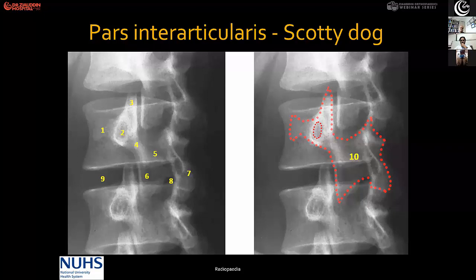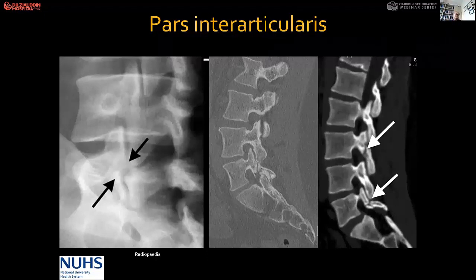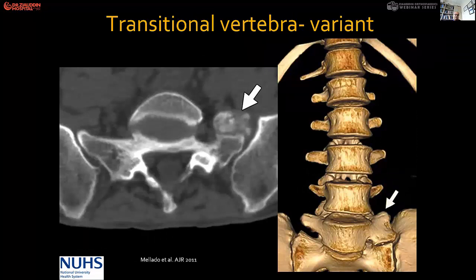The oblique picture shows a defect. The middle picture shows an L5 lysis defect with exuberant callus and osteophyte, while the other picture shows a less aggressive one. This picture shows a sacralized L5 — the transverse process on the left side of L5 is forming a pseudoarthrosis between the ala of the sacrum, which could be the source of back pain, as seen also on CT scan.